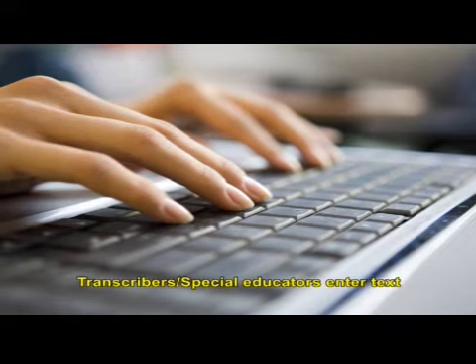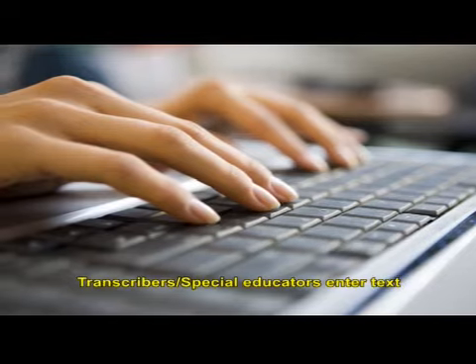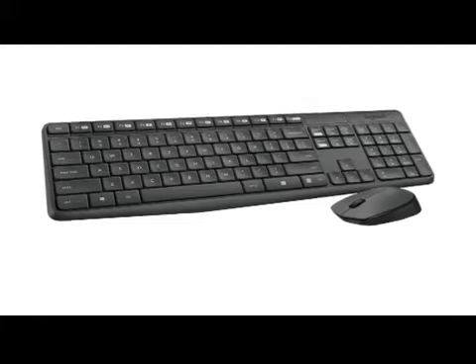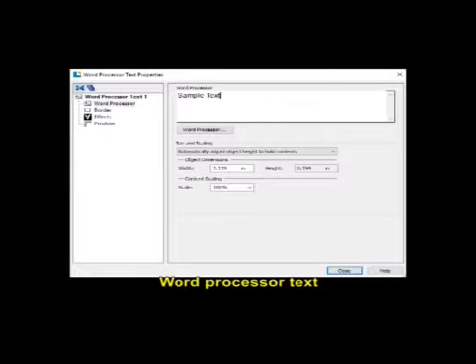Transcribers enter text into a standard word processing program, edit it, and then save it as an electronic file. This file is then opened in the translation software. The translation software can be controlled with either keyboard commands or a mouse. The word processor text can be converted into Braille code and displayed on the computer screen as simulated Braille or Sim Braille, which is a visual representation of embossed Braille.